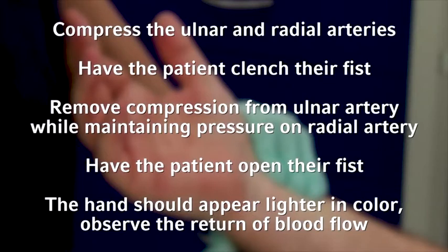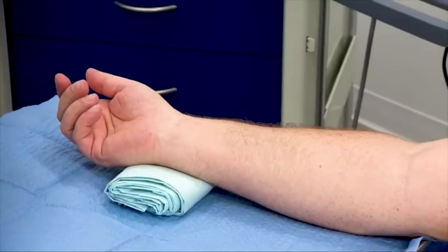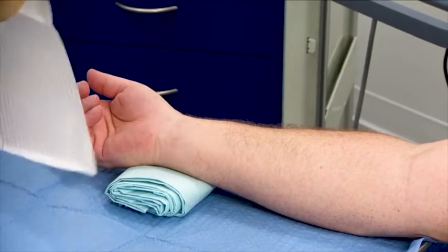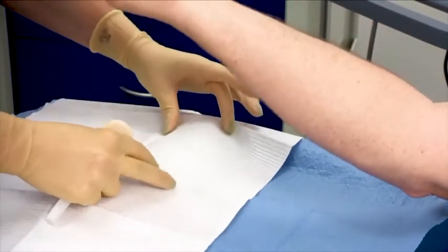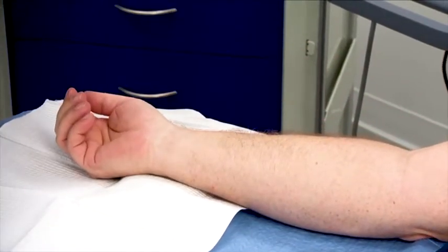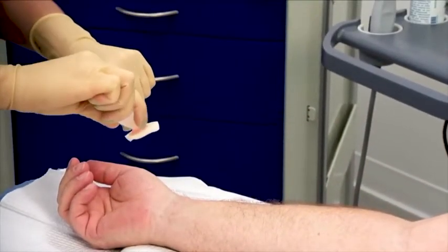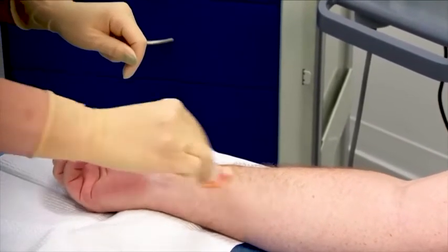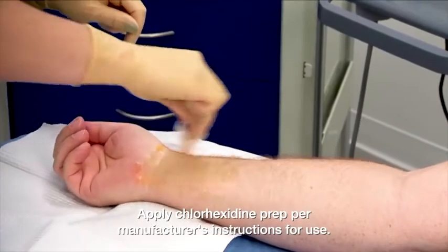The return of blood flow demonstrates a negative Allen's test and indicates that the site is acceptable for radial artery catheter insertion. Clean the patient's wrist with soap and water, then prepare the extremity for insertion. Position the wrist in dorsal flexion to bring the artery in closer proximity to the skin, and secure the hand if needed. Don sterile gloves and prep the insertion site with chlorhexidine-based skin prep per hospital policy, using a scrubbing motion to create friction. Allow the proper drying time per manufacturer's instructions. Apply a small fenestrated drape over the insertion area.